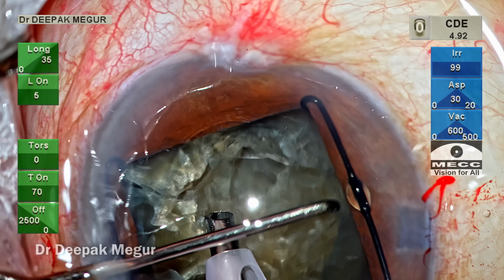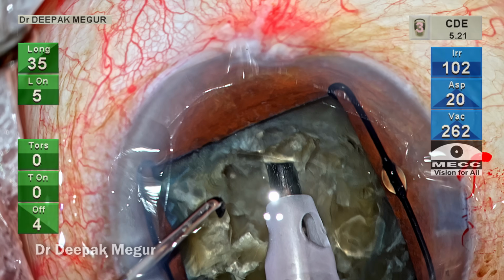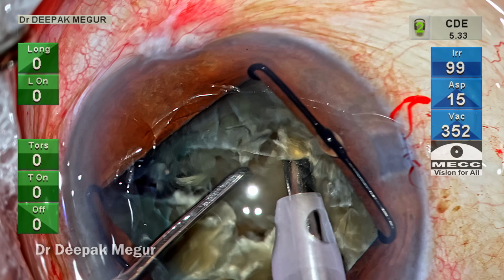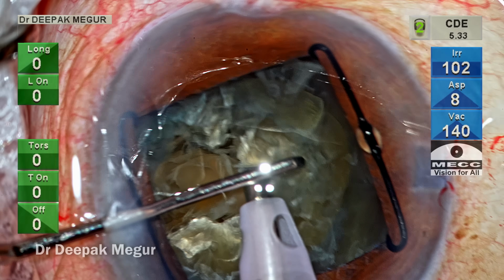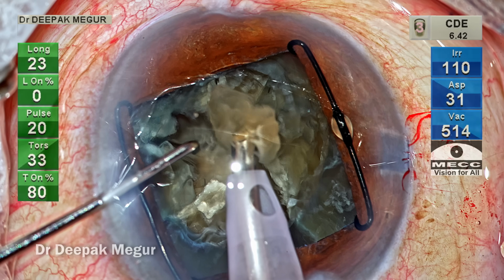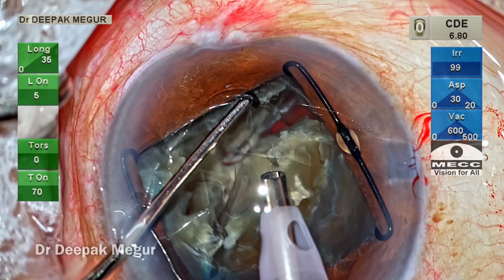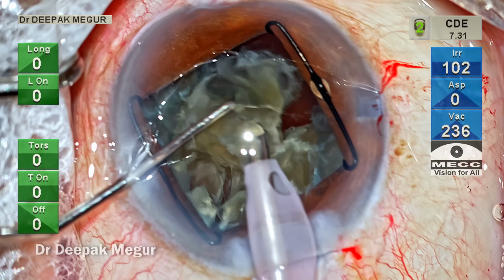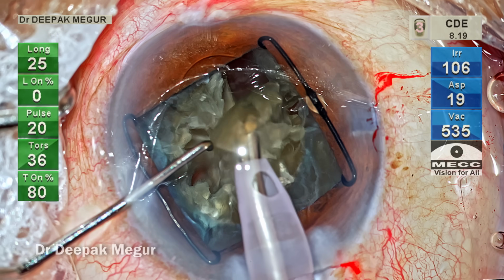The same chopping maneuver is now being done in the second heminucleus. Since the nucleus is relatively dense, we don't expect it to crack in a first go itself. A little bit of patience is required. Multiple attempts of lateral separation ensure that the posterior plate eventually breaks out. So now we have multiple small fragments, and each of them now is being pulled up and emulsified. The plane of emulsification should be at the level of the rhexis margin, preferably. This would ensure clearer cornea on the post-op days.